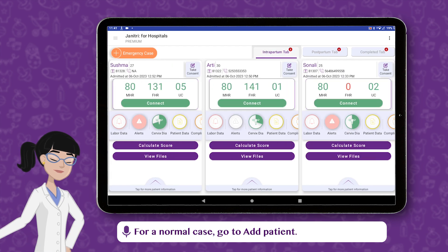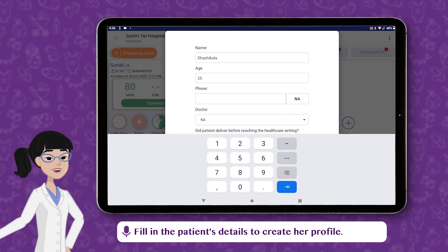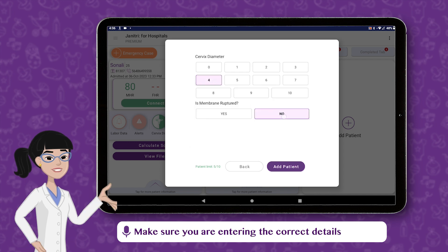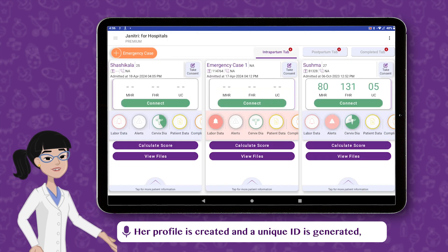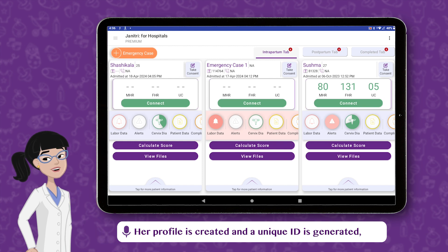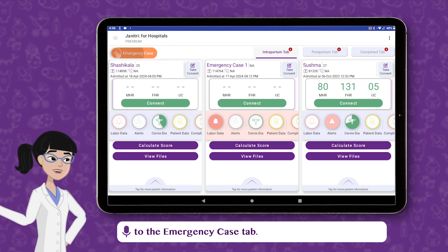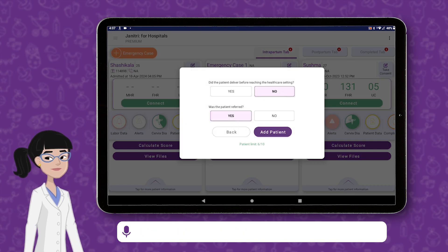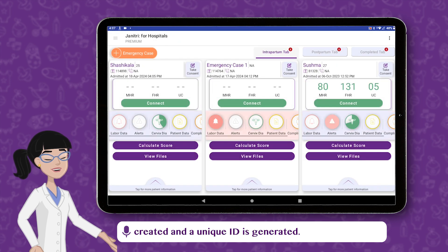For a normal case, go to Add Patient and fill in the patient's details to create her profile. Make sure you are entering the correct details and then tap on Submit. Her profile is created and a unique ID is generated. But for emergencies, head straight to the Emergency Case tab. Make sure to provide all necessary details asked in the form. The profile is created and a unique ID is generated.